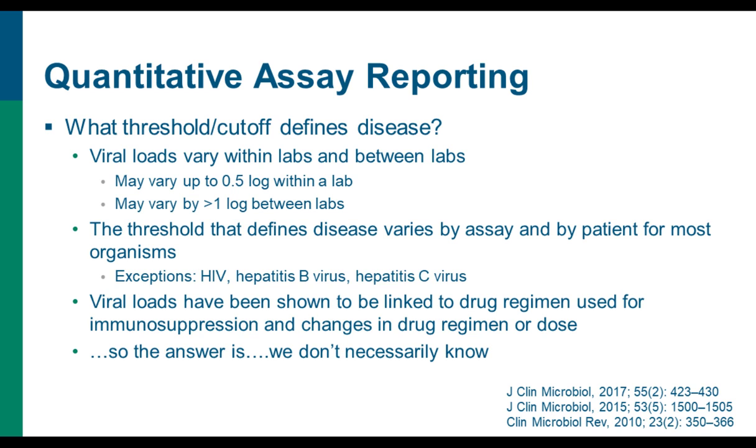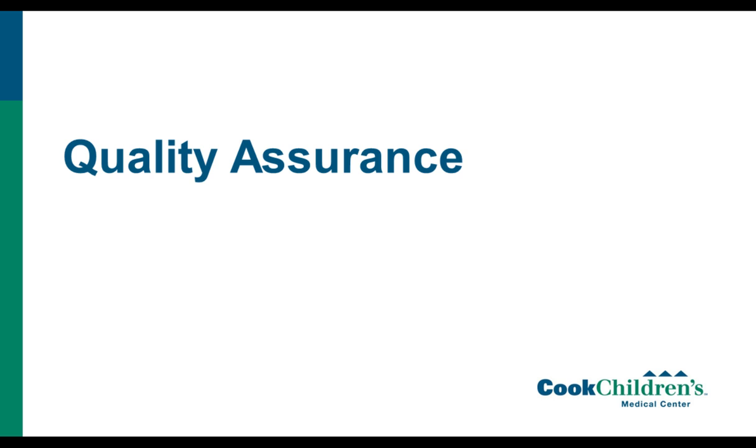In general, we don't know what the cutoff or the threshold is. And again, our clinical colleagues want a hard number of, this is what we're looking for. But for a lot of these assays, we can't give them an answer. It's more about replicate testing, repeat testing, and tracking the trends instead.